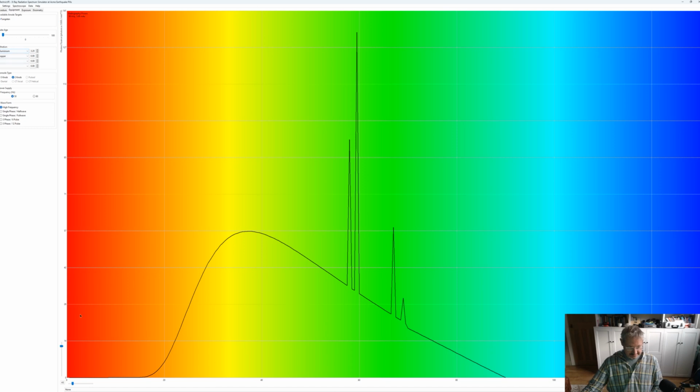So just to orientate people, along the bottom of this graph here we've got photon energy, and along the y-axis we've got the amount of photons of each energy bin. So you can see that we've got very few low energy photons, below 20, and that's because this X-ray tube has 3.2 millimeters of aluminium filtration. It's also got the glass of the tube window.